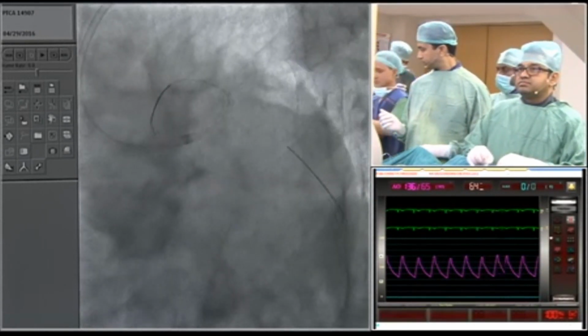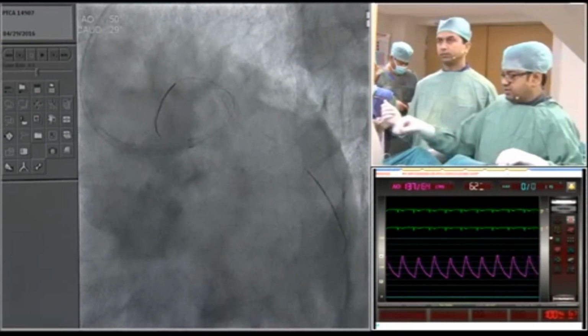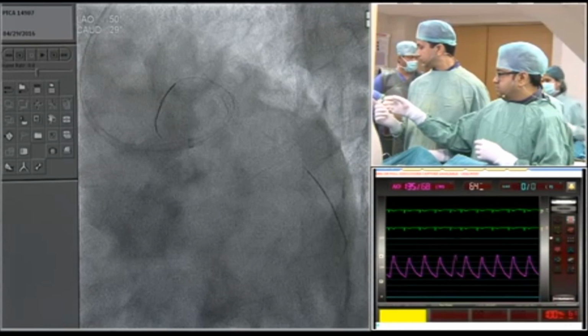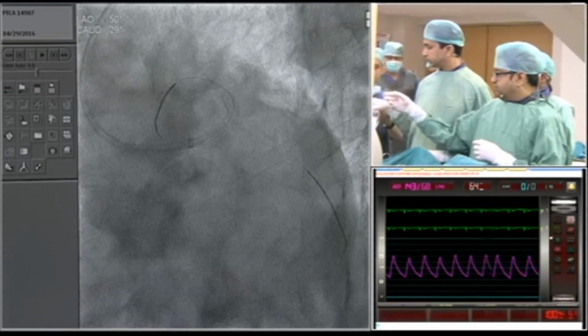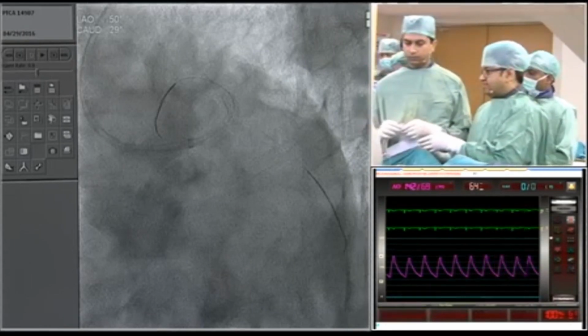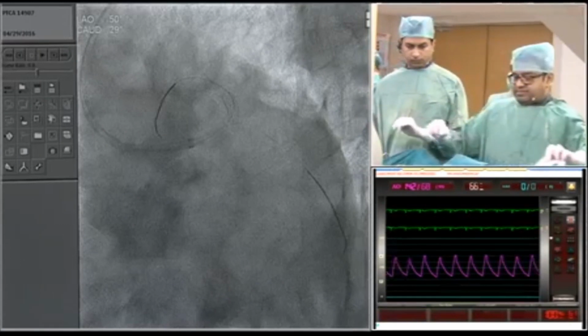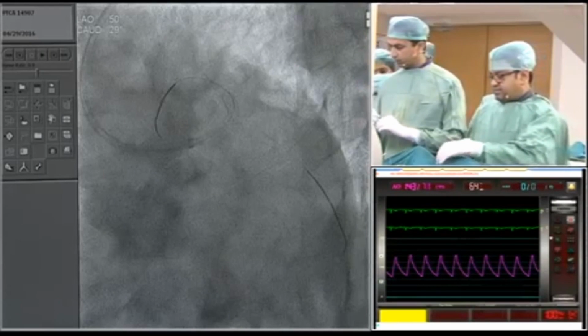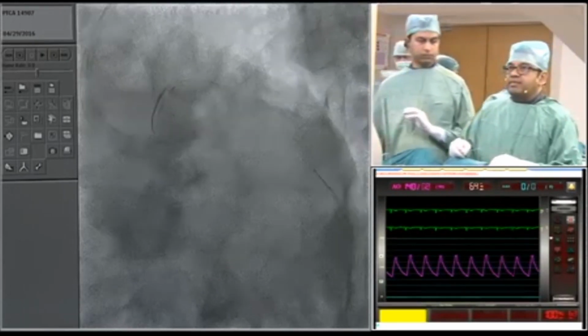That's my only idea, but it's what I feel. I think we are working with very large stents. This stent inflated to 4.5 millimeter. The cells are very well open, and so we don't need to use a small balloon.